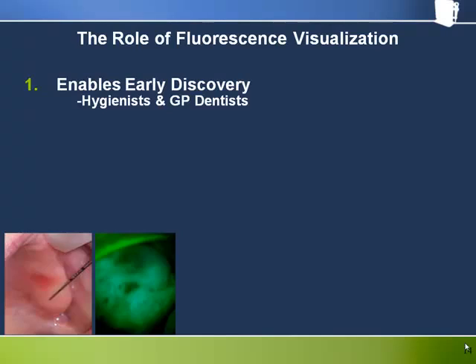This can take the form of outright discovery of an area that was missed by the traditional exam, or increased suspicion about an area that was already noticed but under fluorescence demonstrates characteristics that may cause concern. We'll talk a lot about this when we go through the clinical examples in the later video segments.